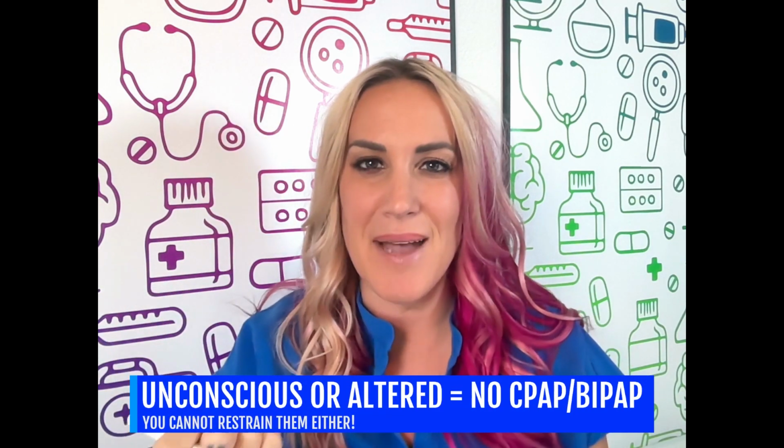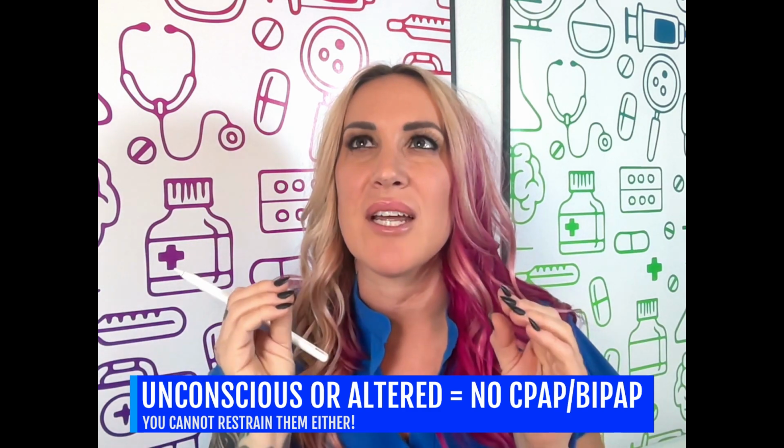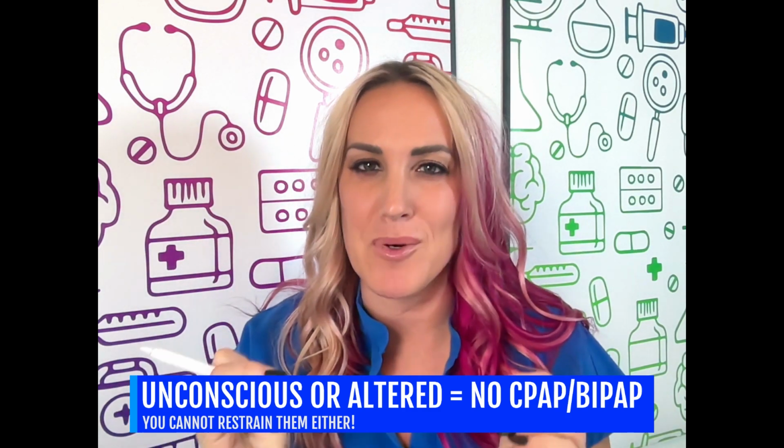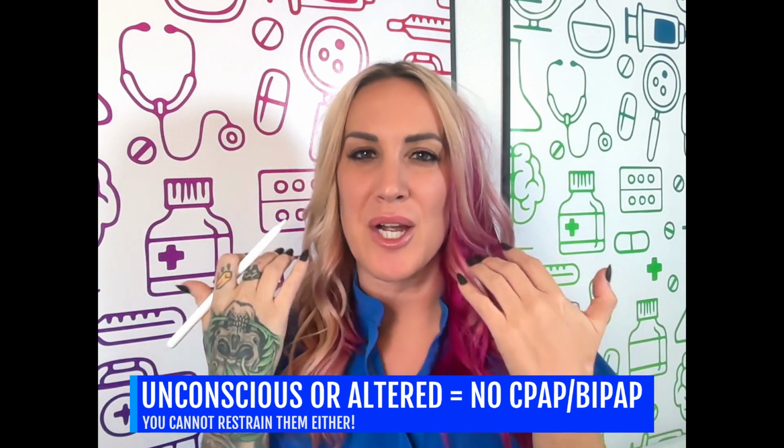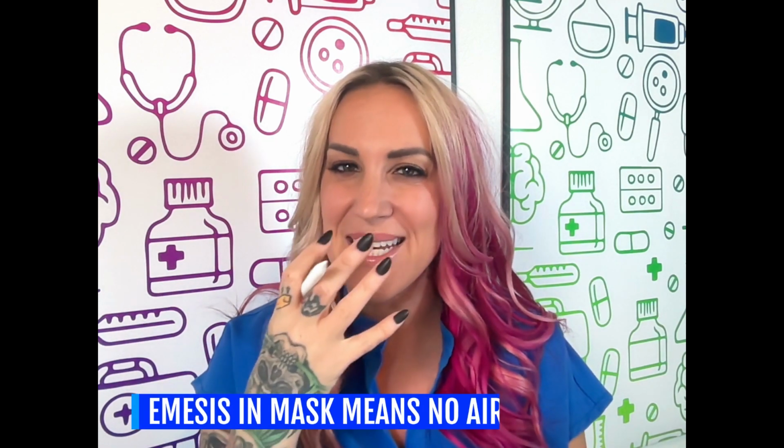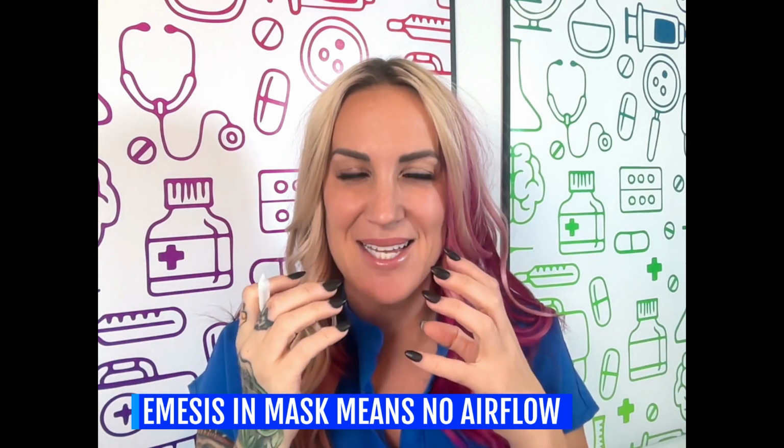So if our patients are unable to take this mask off themselves, then they should not be on BiPAP or CPAP. And the reason for this is when we're pushing pressure down into the lungs, and if this patient happens to get sick, they can always vomit and they can aspirate. Not only will they aspirate pneumonia into their own lungs, but they'll be also sitting in a vomit-filled mask as well. And although that's easy to pop off the mask, our patients don't always know this unless they've been on BiPAP multiple times.